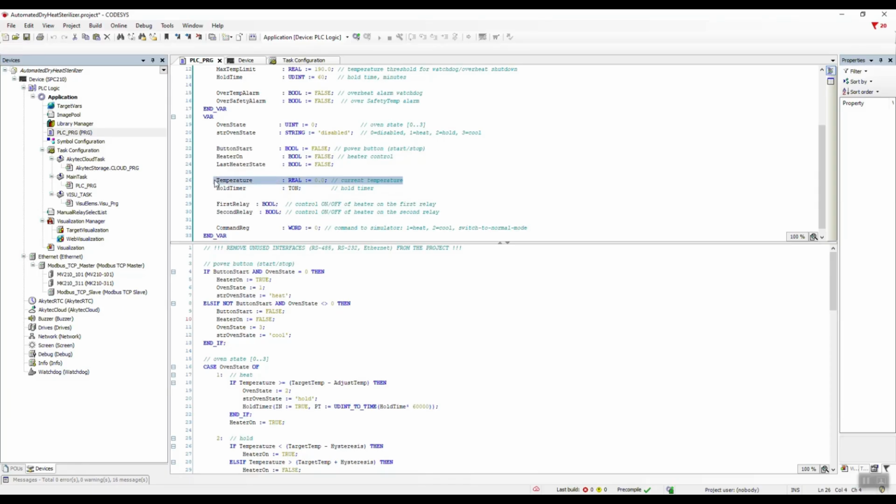Current temperature value. Timer for counting the holding time. Signal to turn the first relay on or off. Signal to turn the second relay on or off. Command for the heater simulator. Value 1 means heating, value 2 means cooling.